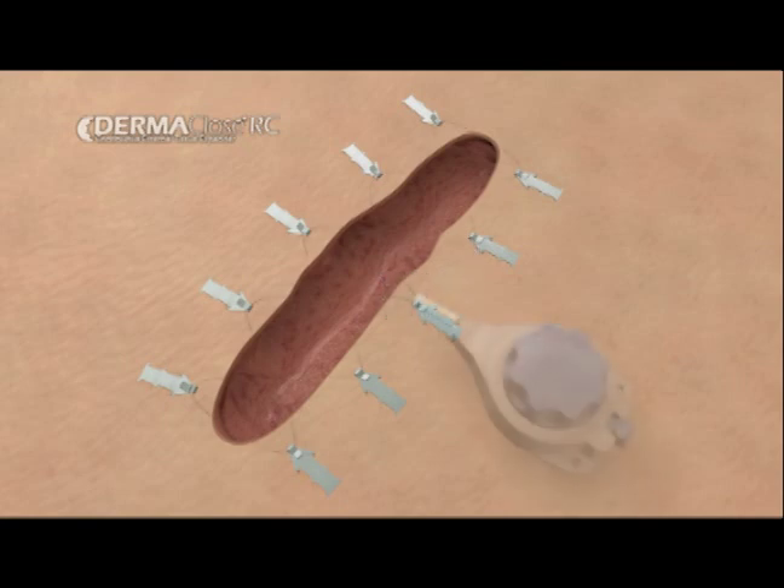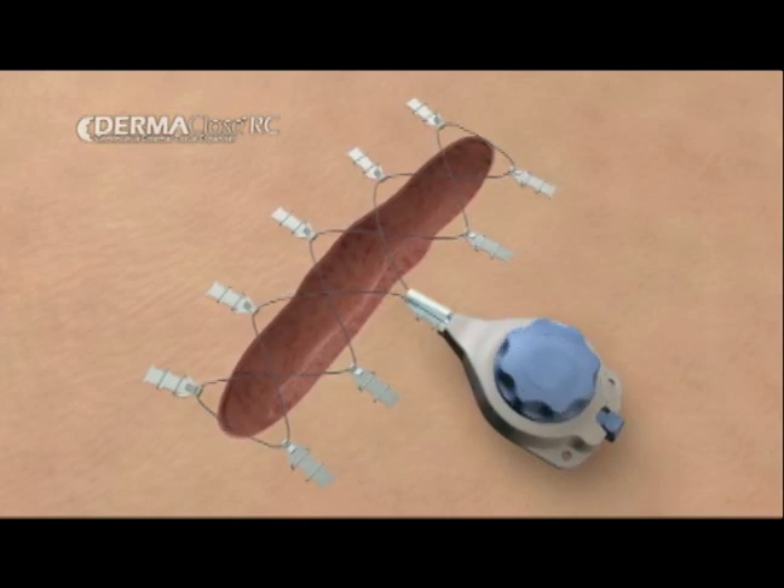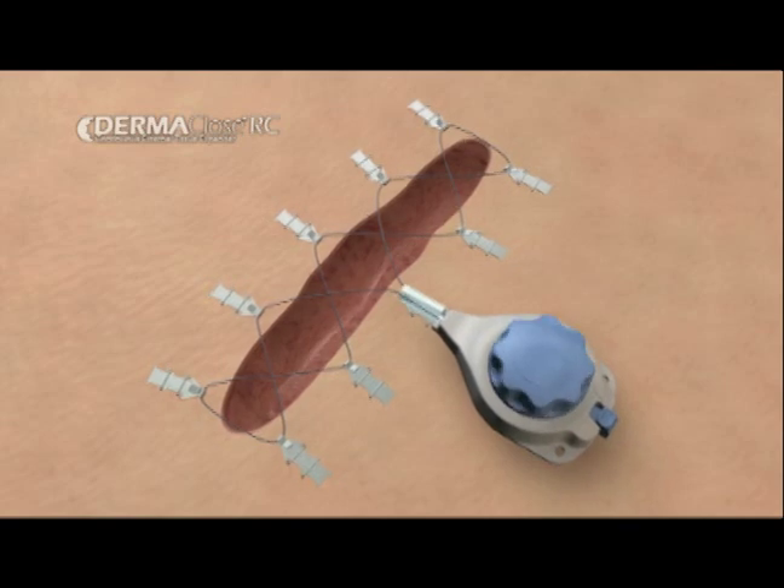Attach the tension controller using the enclosed tension line. Turn the tension control knob clockwise until an audible click is heard. You may then lock the controller.